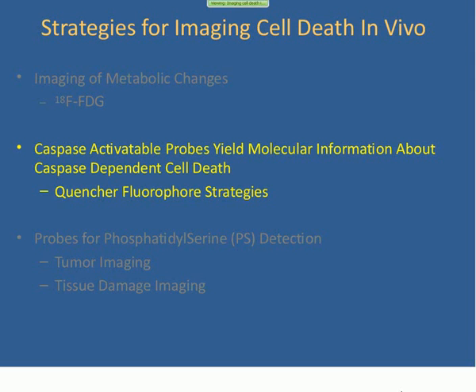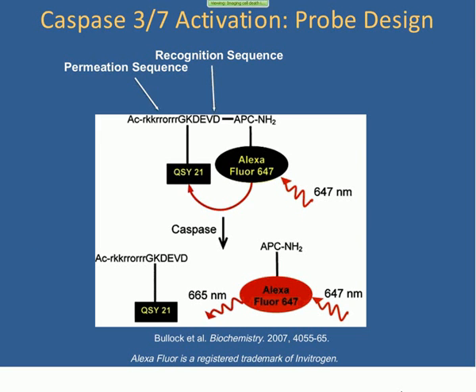But when we looked, as judged by F18 uptake, we saw that in both cases the tumors had relatively little uptake and retention, probably because they both had a radiation dose. But in this case, the top tumor did have the least uptake, and that correlates with the fact that it received the highest radiation dose. So this is a nice example that shows proof of principle that you can indeed use FDG to look at and correlate changes in metabolism with radiation dose.